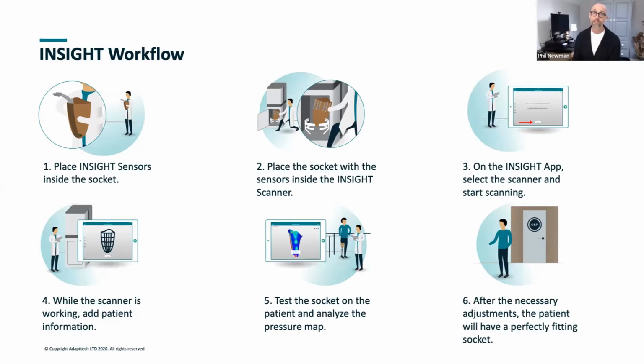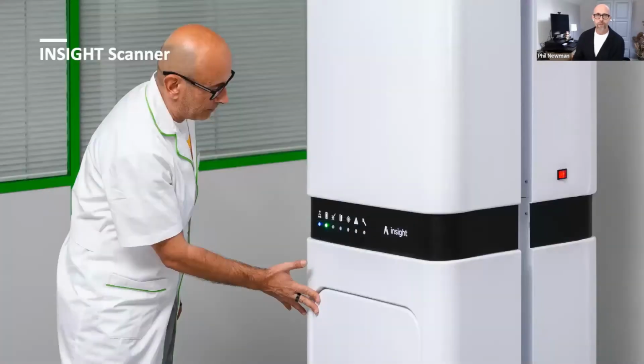The feedback from patients has been very positive too. And as mentioned before, this is all about creating the perfect fit for patients and including the patients and the prosthetist, bringing them together into a faster process and workflow. So Fred's going to talk us through all of the system today.